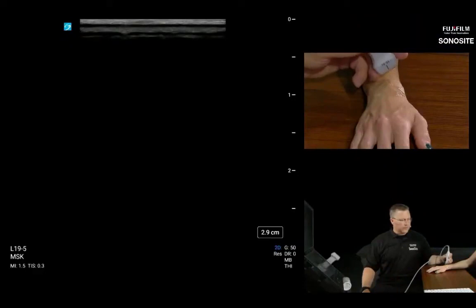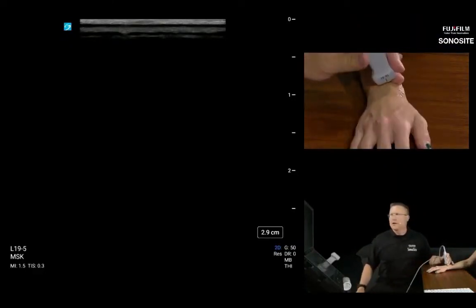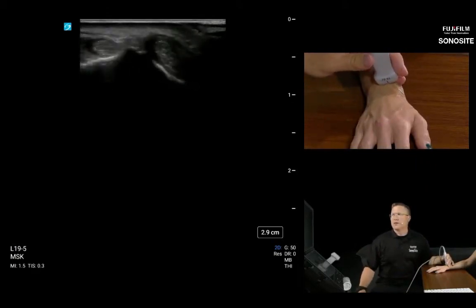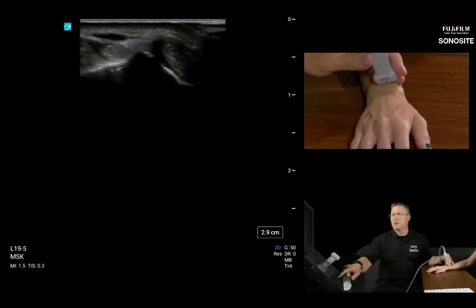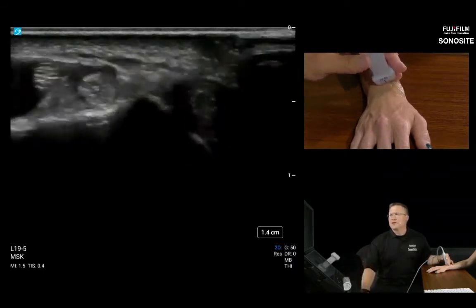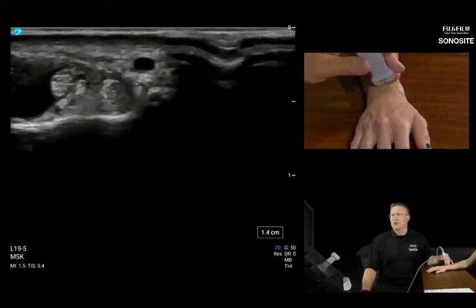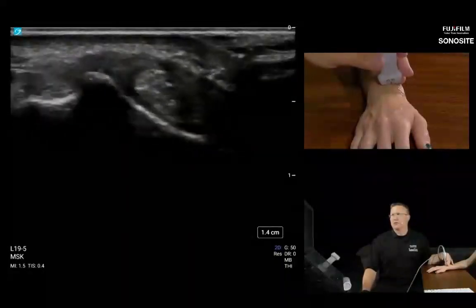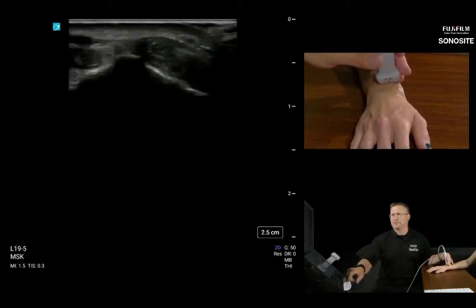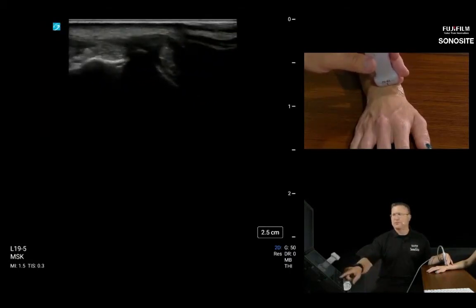All right, so I'm going to start again on Lister's tubercle. I can palpate here, and I can see a much more large bony prominence there. I'm going to bring our depth more shallow. And I like that about this exam type, the musculoskeletal exam type, is that it doesn't start you off zoomed in, so you don't really lose all the perspective. It starts you off pretty zoomed out like this. So you can kind of get a grasp, because we're really about to zoom in.